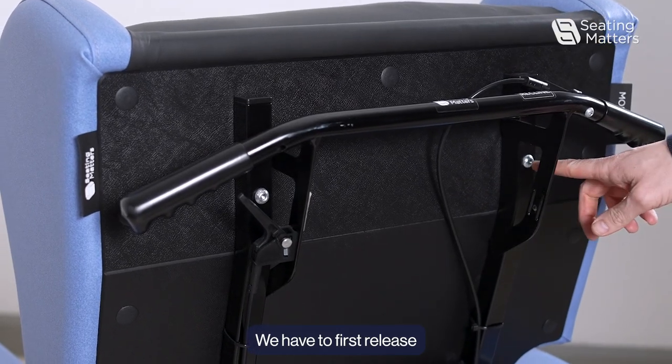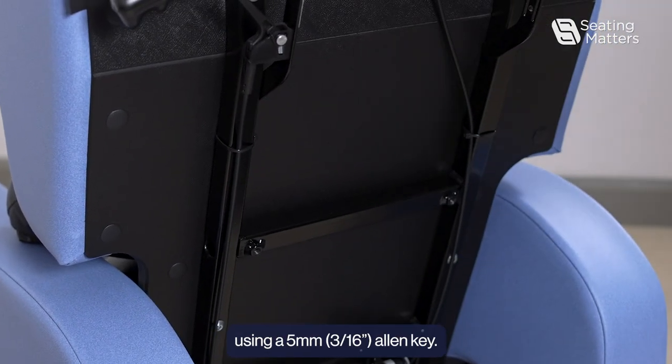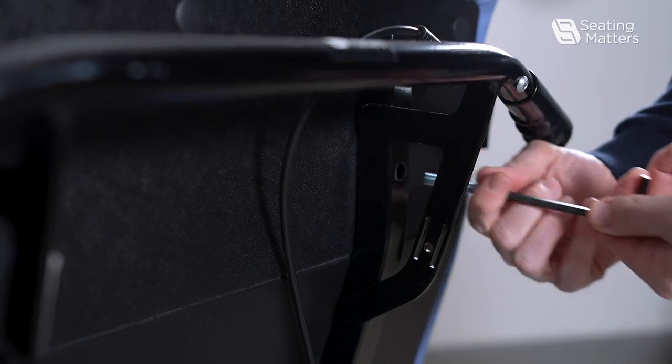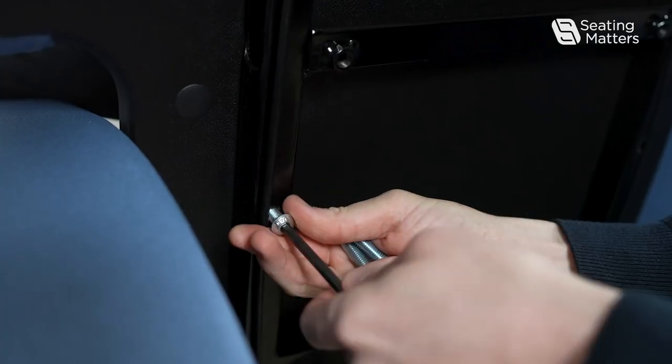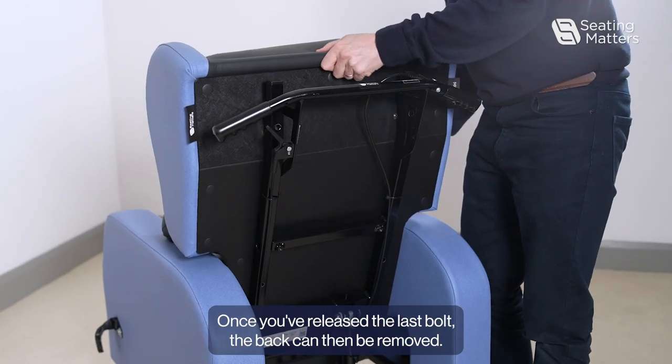We have to first release the four bolts holding the back onto the frame using a 5mm Allen key. Once you've released the last bolt, the back can then be removed.